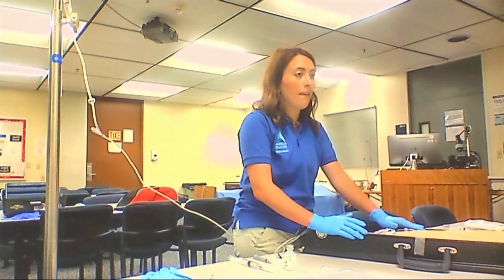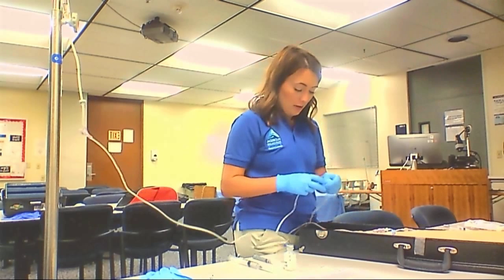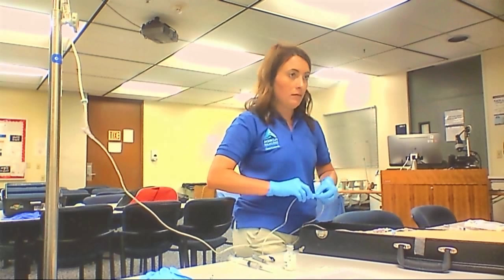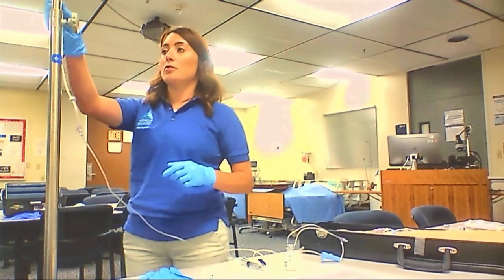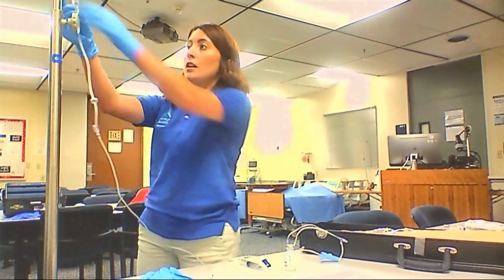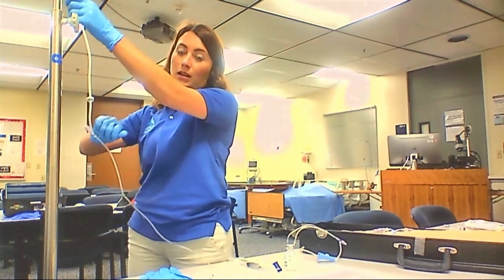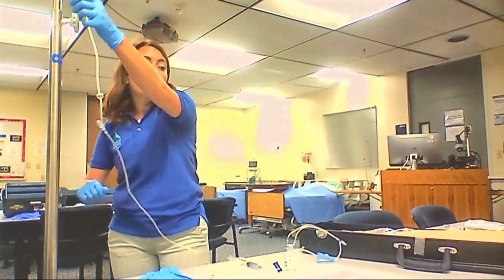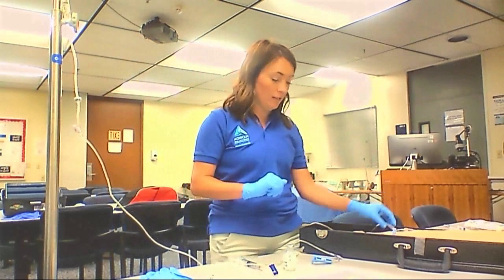At this point, I want to go ahead and clamp and unclamp the line. Then I want to establish a flow rate, making sure that I watch and calculate 17 drips per minute on my IV medication itself. And then I also want to observe the infusion rate, making sure that it is 17 drops per minute as I calculated earlier.